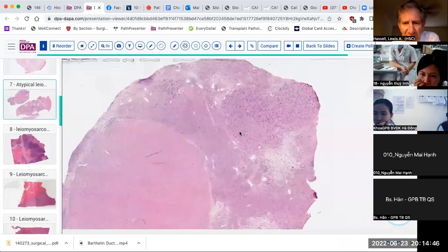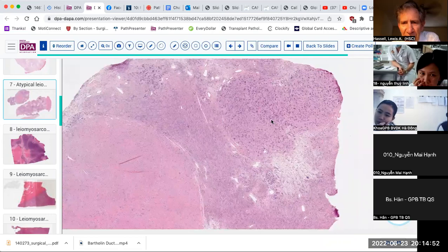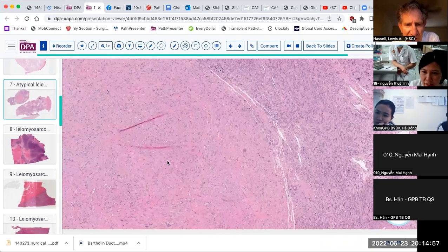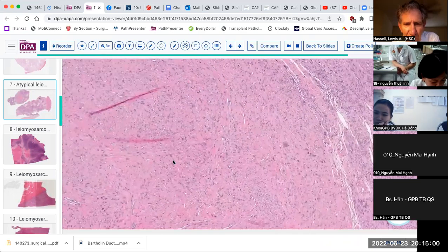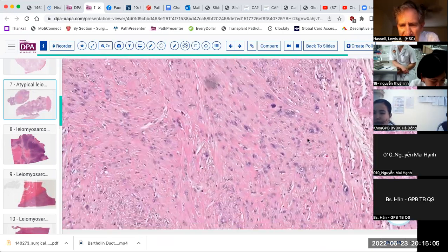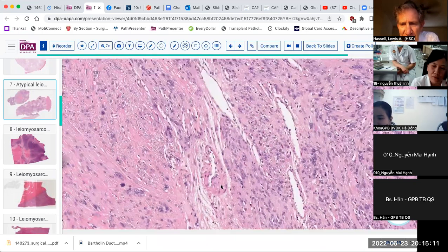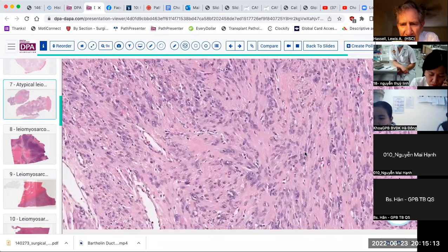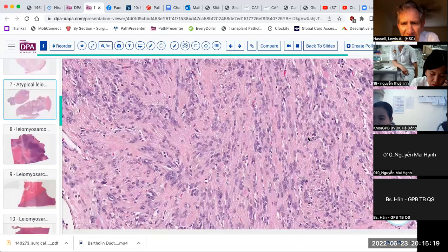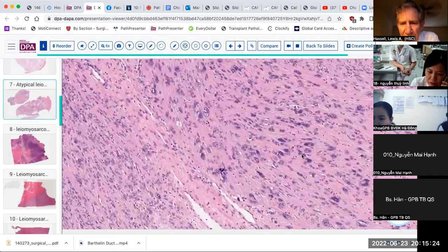But even at this fairly low magnification, you can begin to see that the amount of nuclear material here is quite striking. And compared to, say, this less cellular area over here, it's even more unusual. Although even at high magnification here, we can see that there are abnormal nuclei in this area. So here's an example where the nuclei are quite uniform in some areas, but then occasionally these unusual, or what we say, bizarre nuclei.